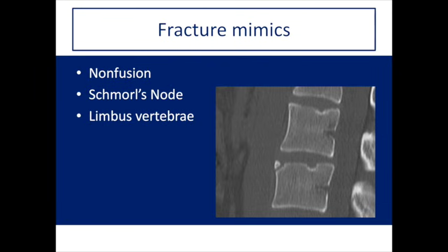Again, if this is too much information for you, for now, focus on the approach. All of these things will come up when you read about C-spine and look at more C-spines. For now, just having heard these names puts you way, way, way ahead of the game.